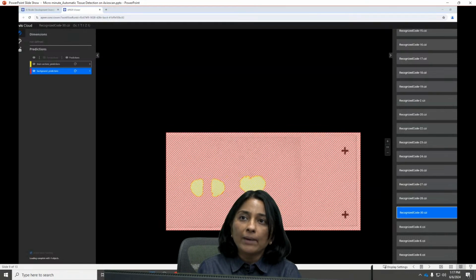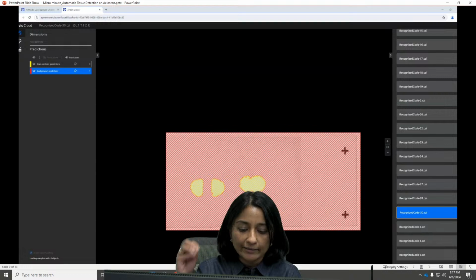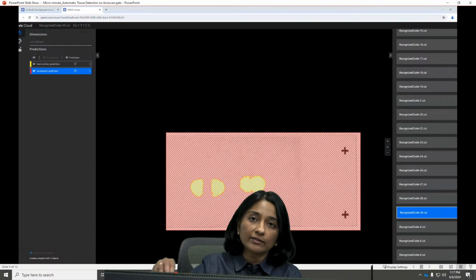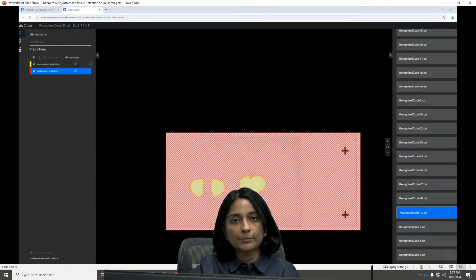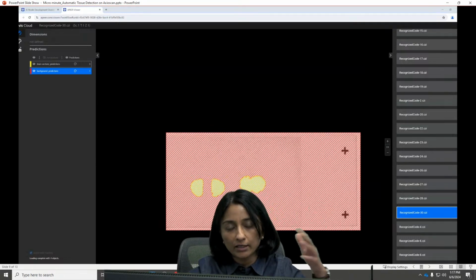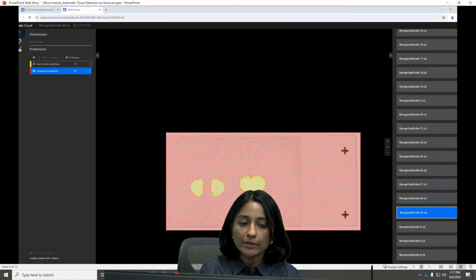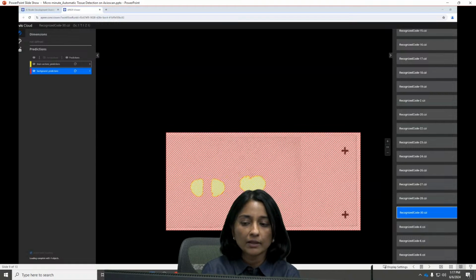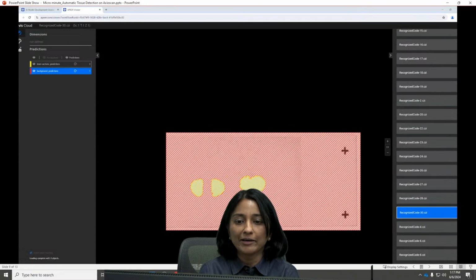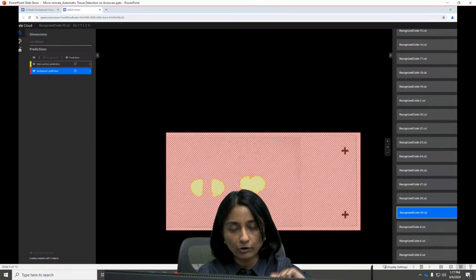So bubbles and anything on your slide that you don't want the tissue detection method to pick up, and you don't want to be spending time screening through these slides, right? In my personal experience, these models that we create on the cloud work by far the best in terms of avoiding all the bubbles, because you are just training them on your tissue or regions of interest.